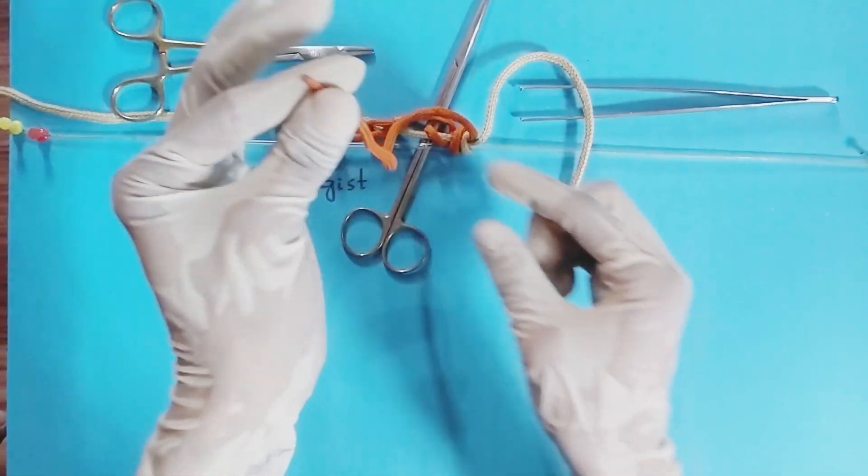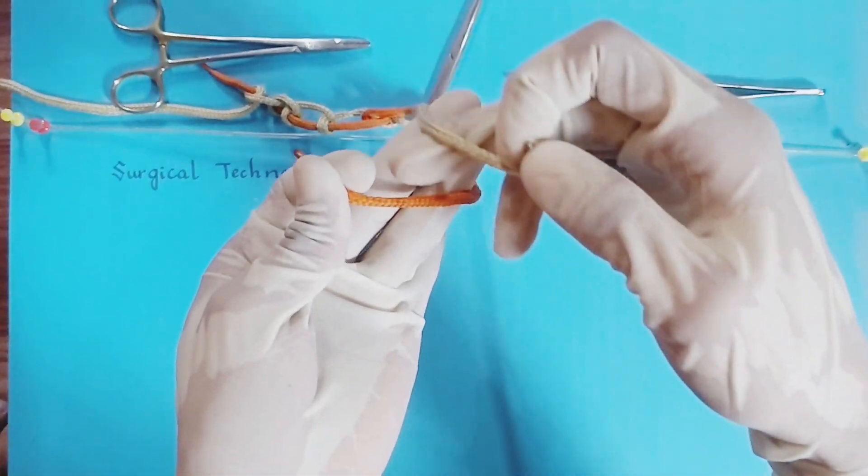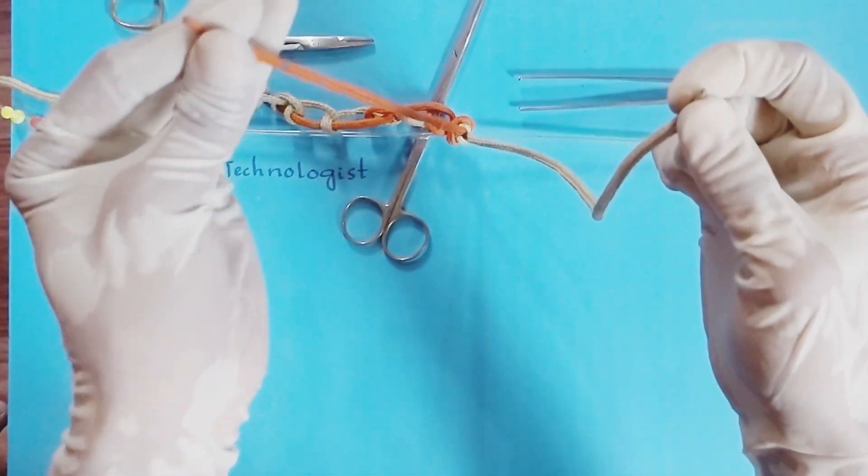First, hold the suture thread on your dominant hand thumb and index finger, then push the thread from middle and ring finger.